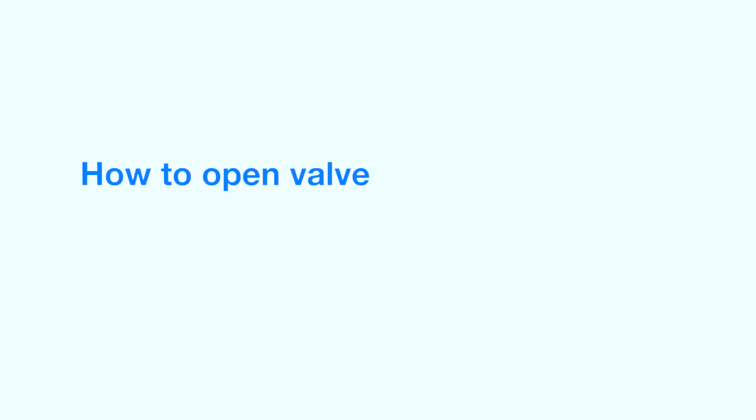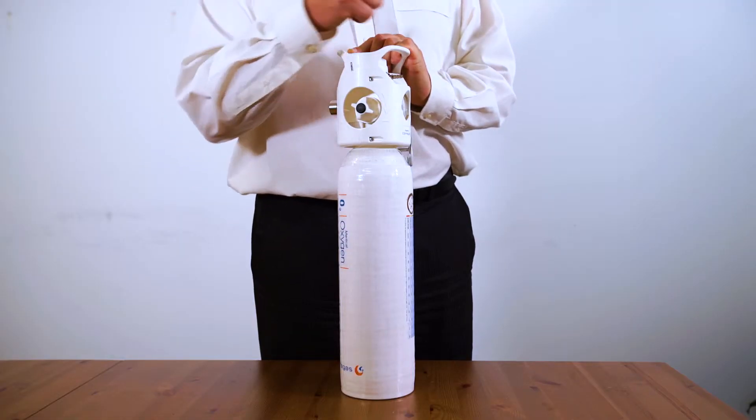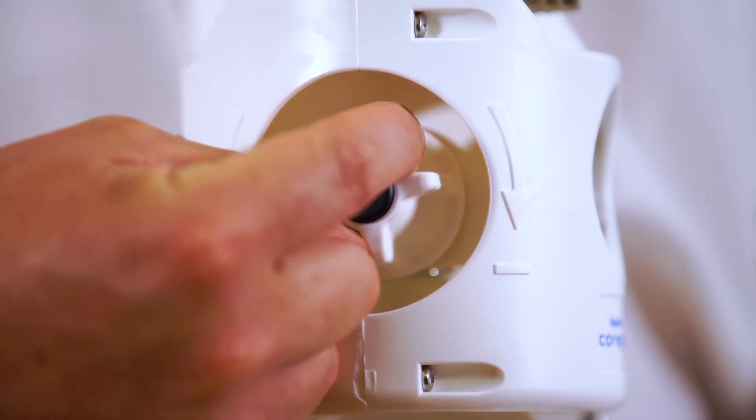This valve is used to open and close the cylinder. It must be open to allow gas to flow from the cylinder through the regulator to your patient. Simply turn it anti-clockwise one full turn.